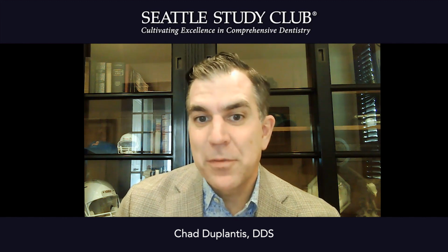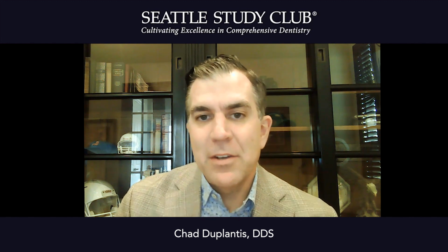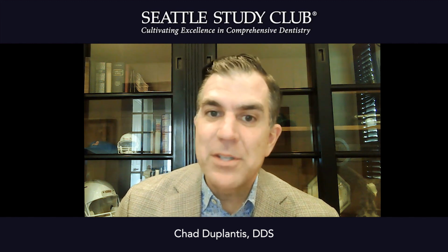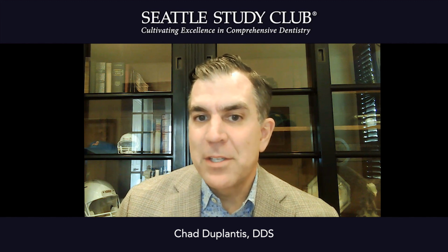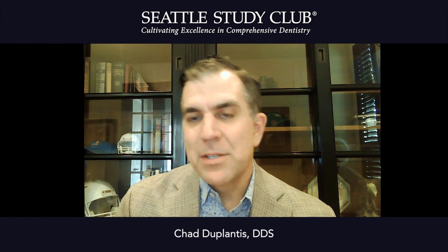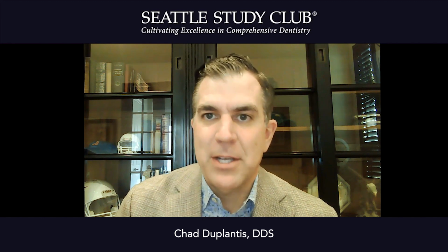The N stands for the nasopharynx and sinuses. This is what we're going to look at next. We're going to look at the anatomy of the nasopharynx and note any abnormalities. The T stands for the temporomandibular joint. Although this is not present on every single CBCT that we take, we want to make sure that we analyze it if it is present on the field of view that we've taken. In addition, these CBCT units can actually take minimized images of each of the temporomandibular joints, which is a really nice specific image when you're looking just at the TMJ.